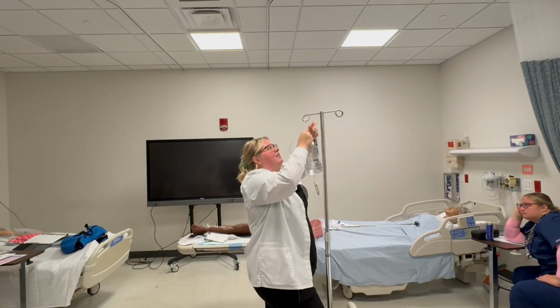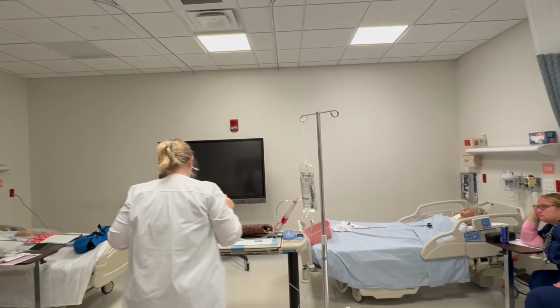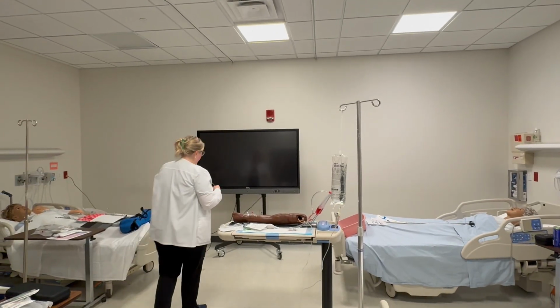I bet you guys didn't think you were gonna get a magic trick today. But you're gonna lower this primary, okay? And you'll see why in a minute.